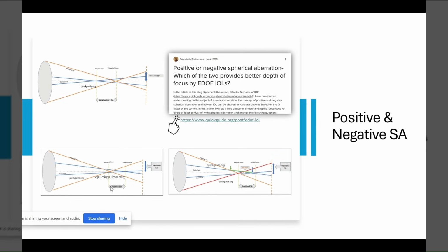Similarly, here, this region between the paraxial focus and the marginal focus is the positive spherical aberration region. Where will the patient's best focus be? In terms of positive or negative spherical aberration, it is neither on the paraxial focus nor on the marginal focus, because things will be blurred since not all the light is coming to one point.